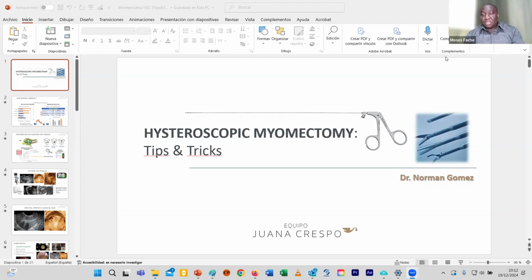Thank you, Professor Gomez. I think one of the challenges with doing hysteroscopic myomectomy, apart from trying to do fibroid mapping, is determining the size of the fibroid. One of the mistakes is for someone to think that a 4-centimeter fibroid is just double the size of a 2-centimeter fibroid.